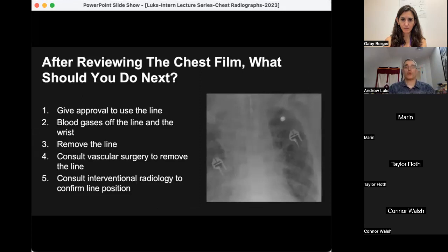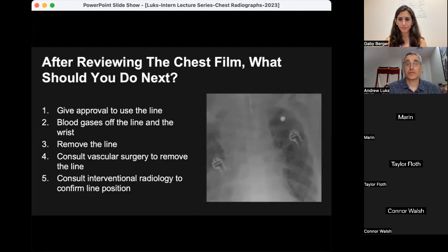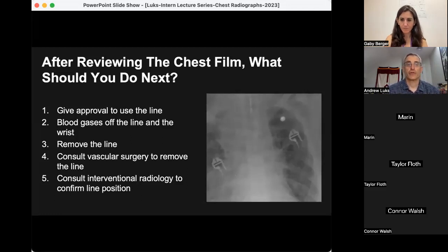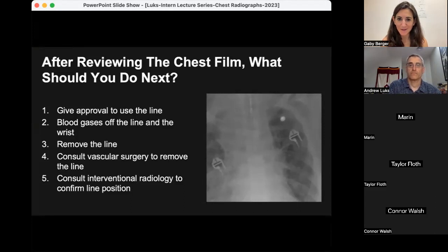The film is still up on the screen. We're going to ask a question: after reviewing the film, what should you do next? Should you give approval to the nurse to use the line? Should you obtain blood gases off the line and the wrist simultaneously? Should you remove the catheter? Should you consult vascular surgery to remove the catheter? Or should you consult interventional radiology to confirm the line position? Go ahead and put your responses in — this is completely anonymous. Put your nickel down; commit to something — that's how we learn.